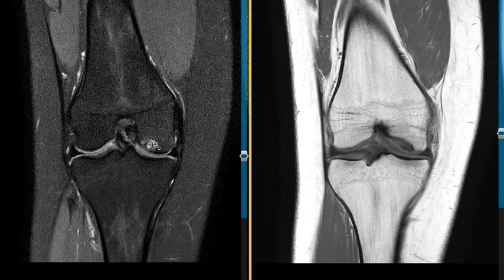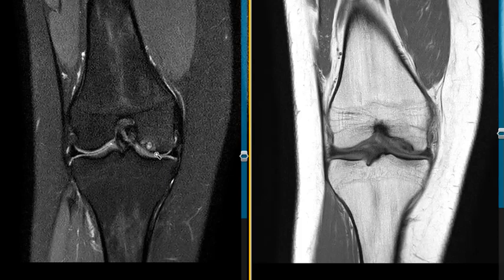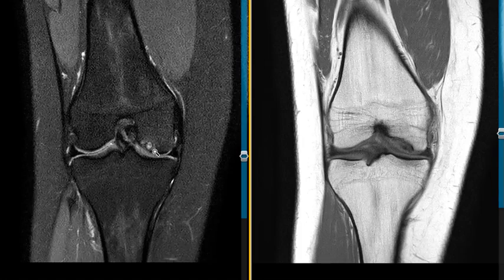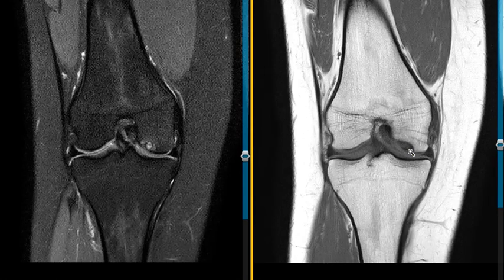There is no fluid dissecting between the osteochondral defect and the bone, so this is not loose. There's no fluid in between them and there is no displacement. So we say this is an osteochondral defect with a little bit of marrow edema, compatible with osteochondritis dissecans, with no evidence of loosening or displacement.